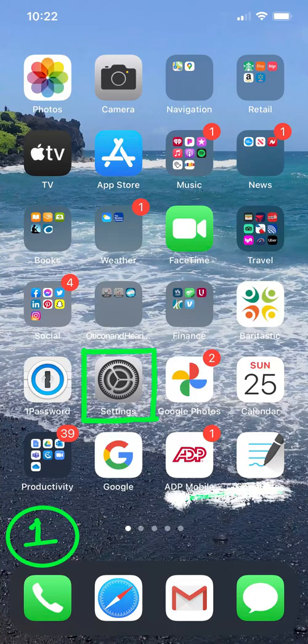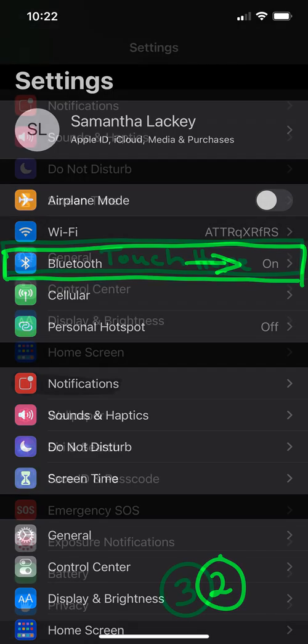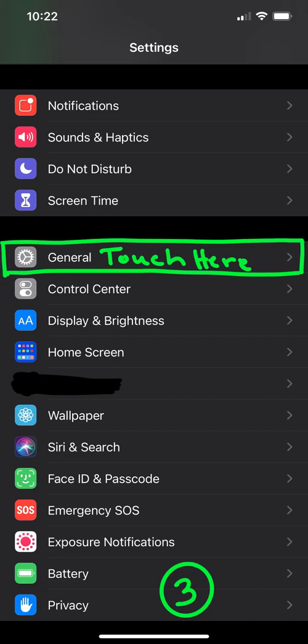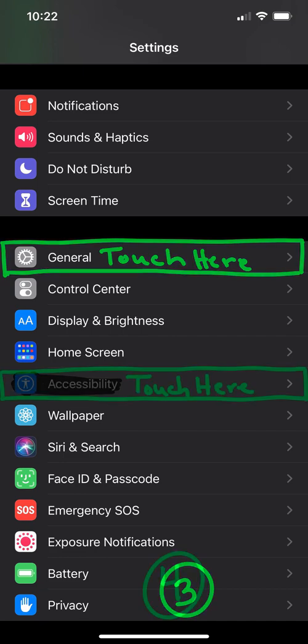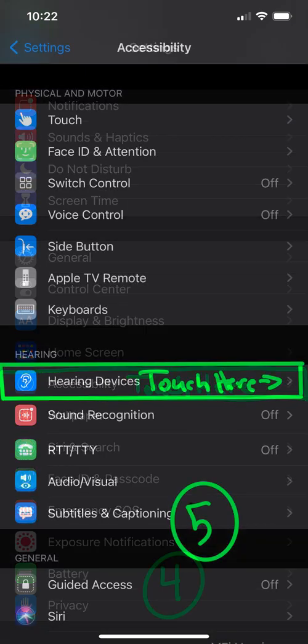Slide number one: touch the green box where Settings is. Number two: go to Bluetooth, make sure it's in the on position. Slide number three: scroll down to General, go to Accessibility.